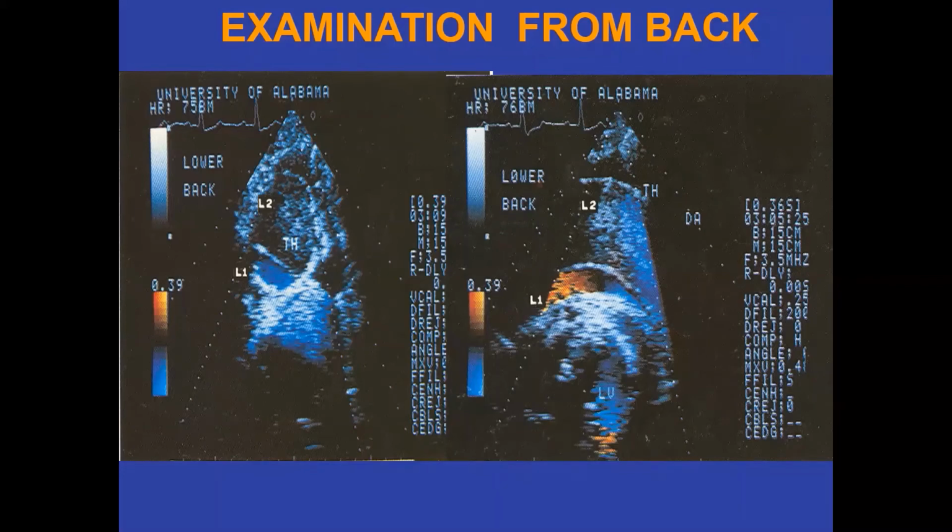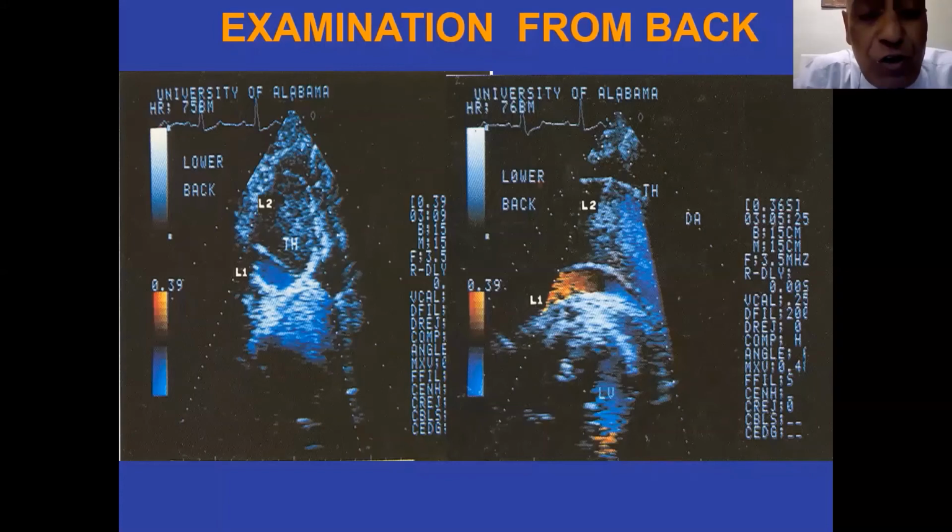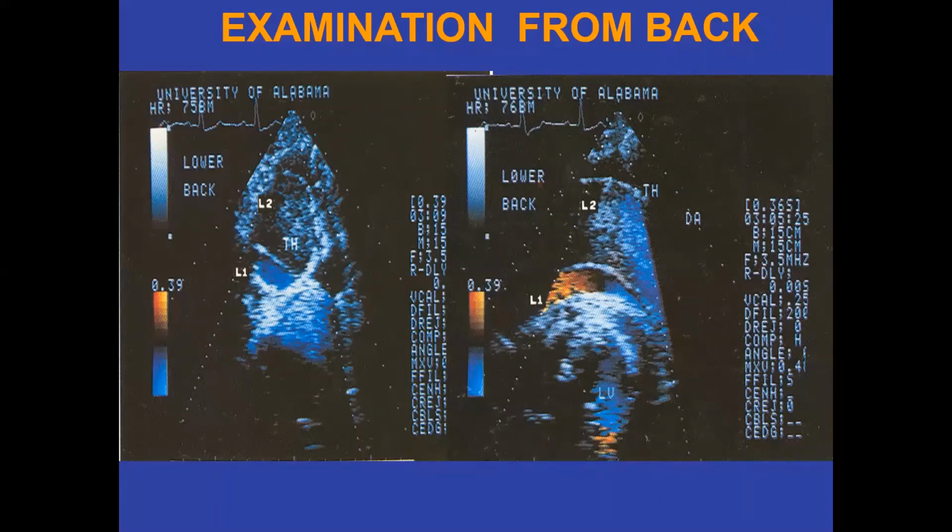So the next question is from Dr. Rajesh. How to differentiate between different aortic flow reversal? Now, the aortic flow reversal is sometimes used in aortic regurgitation or in PDA, but mainly in patients with aortic regurgitation. I think you had a lecture from Dr. Kasliwal on that also. Yes, sir. I think he must have mentioned it.